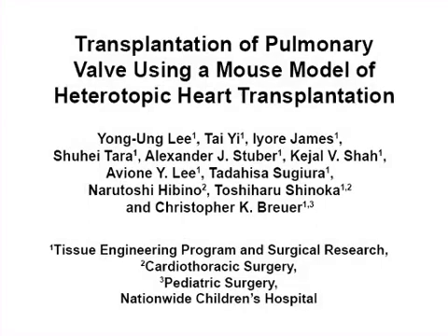The overall goal of this procedure is to investigate the cellular and molecular mechanisms underlying neo-tissue formation, valve thickening, and stenosis development within a tissue-engineered heart valve.